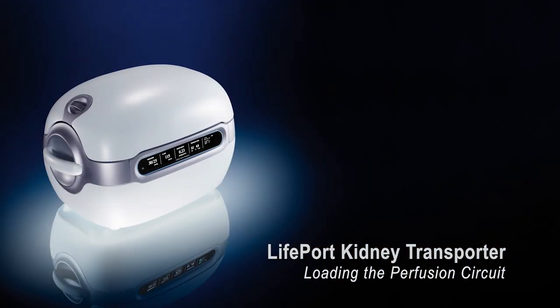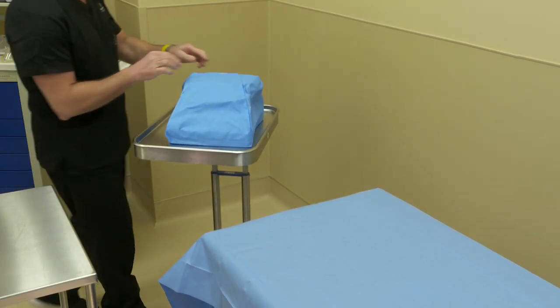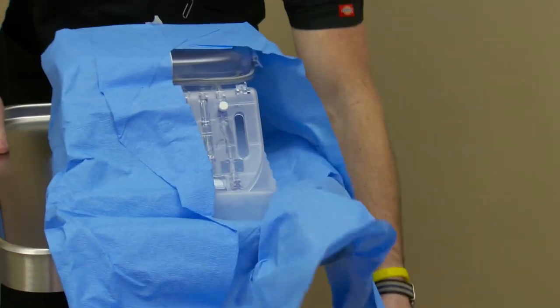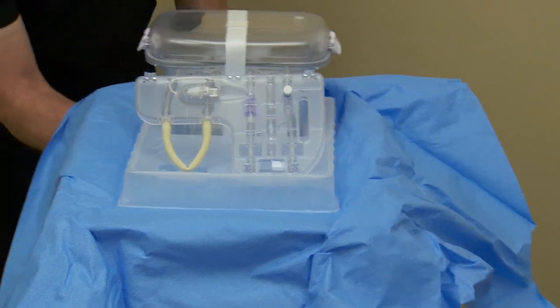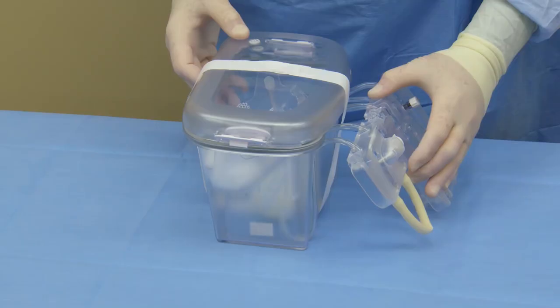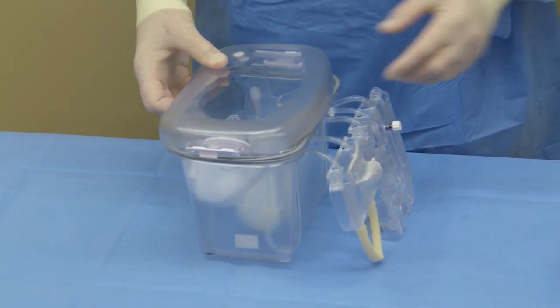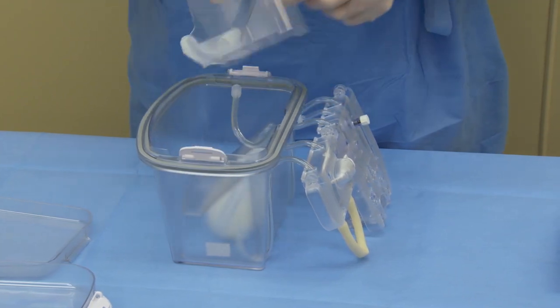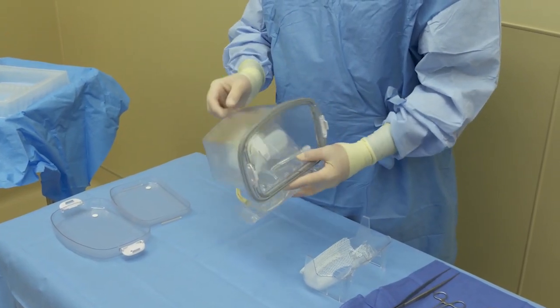Loading the Lifeport Kidney Transporter Perfusion Circuit. Remove the sterile perfusion circuit from its protective outer dust cover. Place the circuit on a mayo stand or a back table, wherever is convenient to open in a sterile fashion. A person who is part of the scrubbed-in team will then remove the perfusion circuit. Remove the paper tape securing the inner and outer lids to the perfusion circuit. Remove the inner organ cradle and perform an inspection of the perfusion circuit, ensuring nothing is cracked, broken, etc.